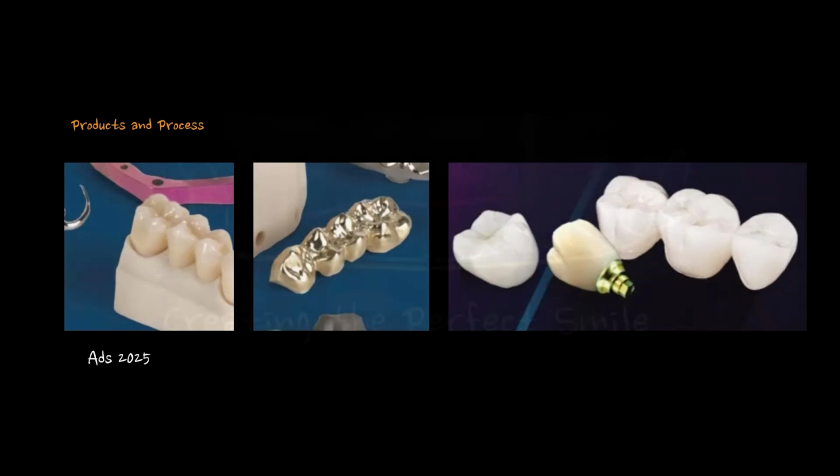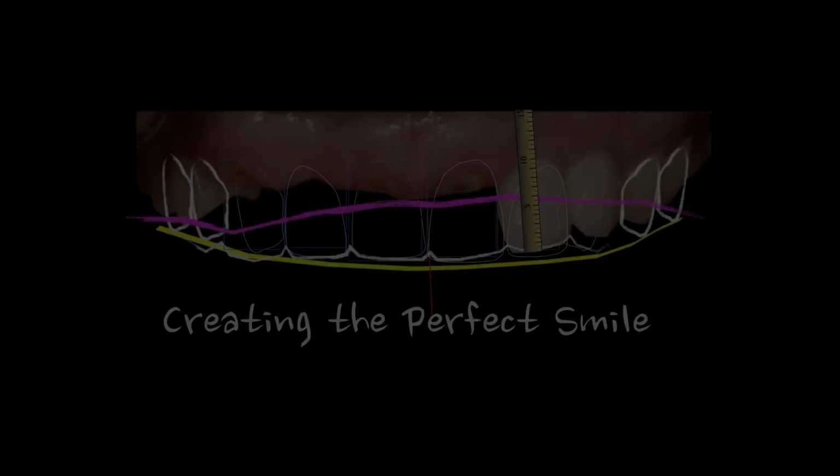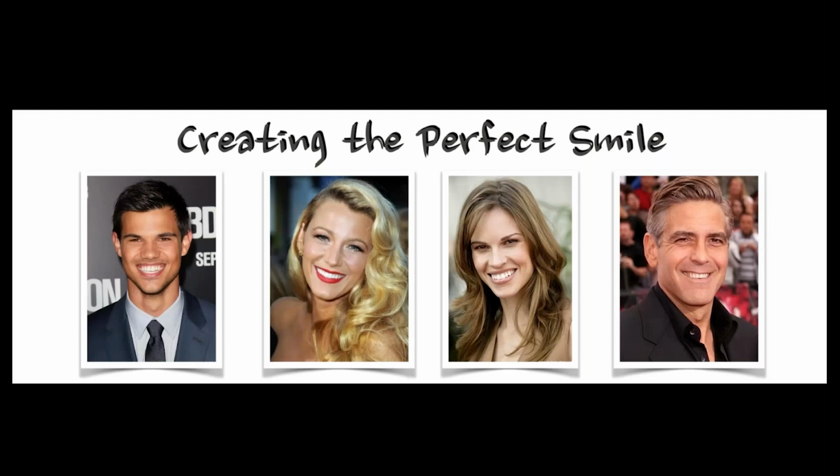It doesn't really work for us, because when we're working through a smile, we have to look at so many details and have so much information about the material selection, the position of the teeth, the position of the gums, how they flow in the face. These are all the things that become much more critical. Obviously, in the end, making pretty ceramics or pretty lithium silicate or zirconia is still just as important. It doesn't go out the window because we have the ability to hit a few buttons now and then.